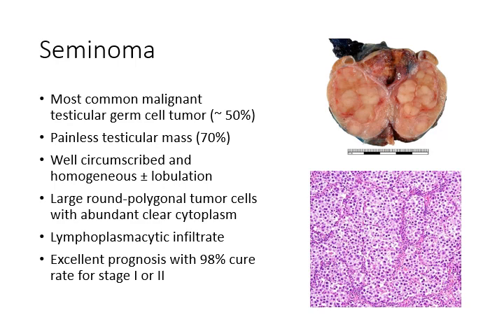So this is the seminoma. This is a more homogeneous tumour. Seminoma usually occurs in that 35 to 45-year-old age group, and this represents the most common type of testicular germ cell tumours. Again, as with all of these, it usually is a painless testicular mass, and often you can tell when you cut the specimen that you're dealing with seminoma, because it has this vague lobulated appearance and this rather homogeneous pale light pink colour.